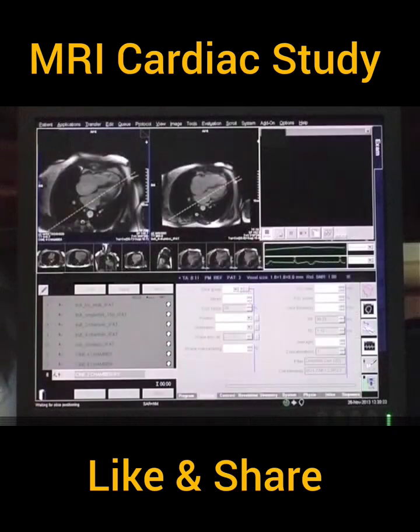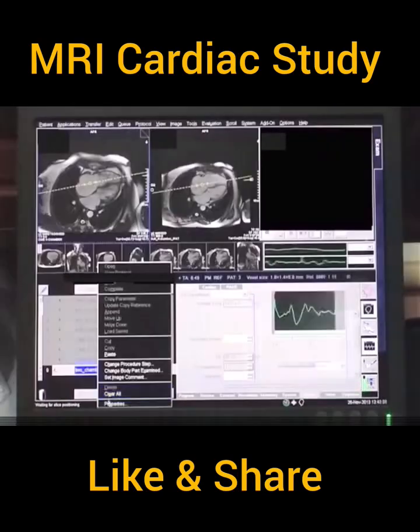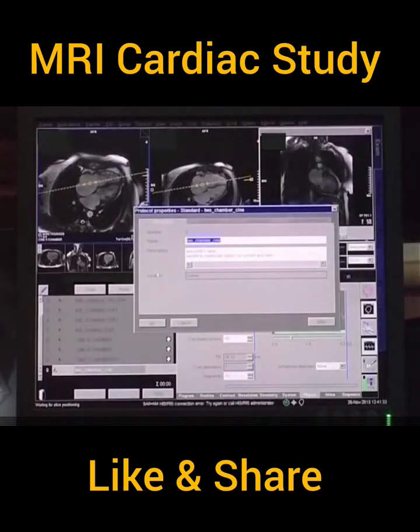A true two-chamber view is planned on the true four-chamber view by drawing a line through the left atrium, mitral valve, and the LV apex. Since the pathology is on the right side of the heart, a true two-chamber view of the right side is obtained by drawing a line through the RA, tricuspid valve, and RV apex.